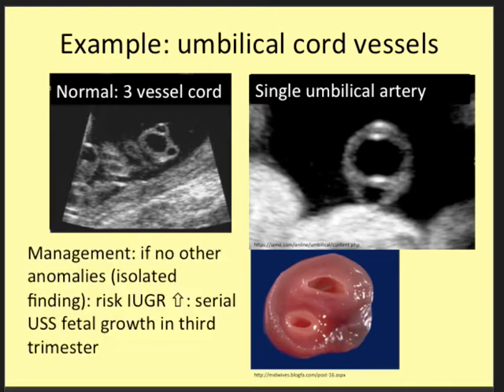We look for, of course, other anomalies, but if no other anomalies are found, and hence it's an isolated finding, the only thing we know is that there's increased risk for intrauterine growth restriction. So that means that we will not continue to measure the fundal height as usual, but we will refer to serial ultrasound scans of fetal growth, particularly in the 3rd trimester, with an interval of roughly 3 weeks.